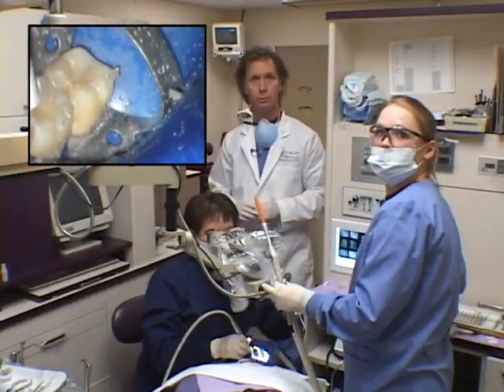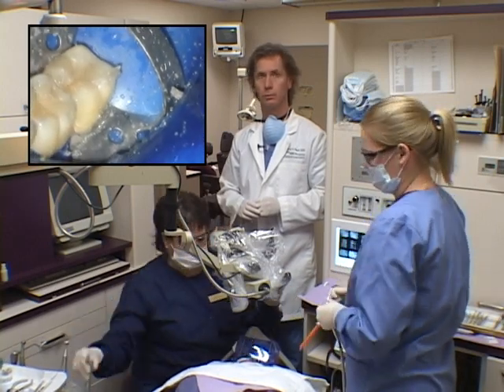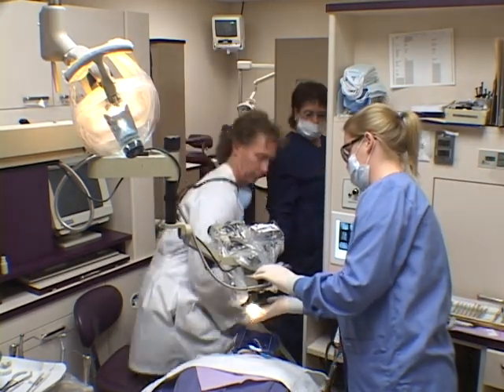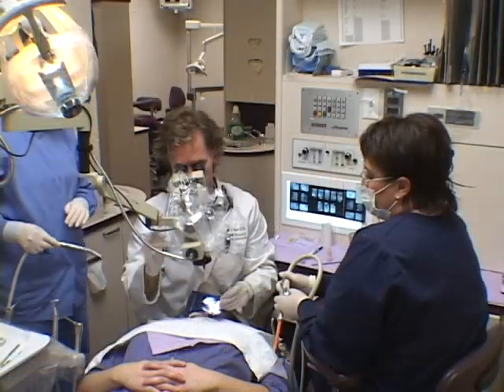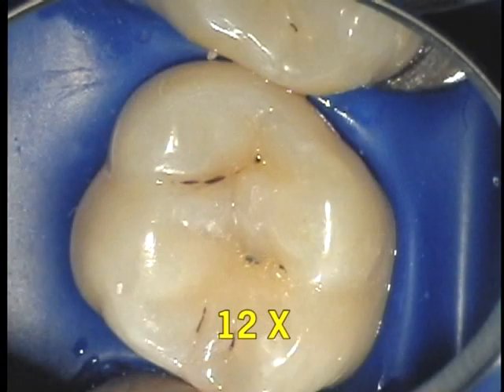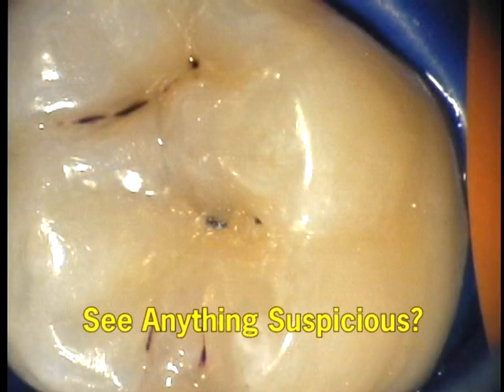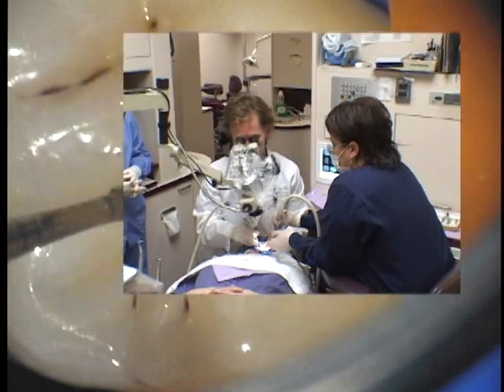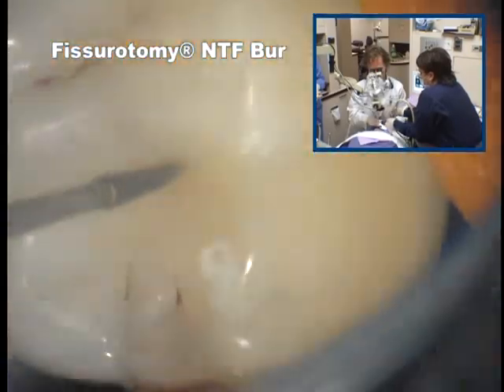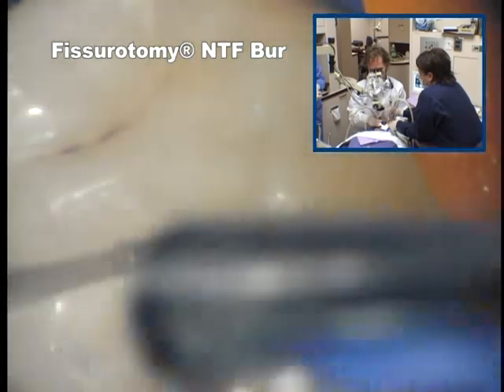The tooth must be cleaned with sodium bicarbonate, pumice, and finally with fissurotomy burrs. Here, I am removing decay and decontaminating the grooves. There is simply no other way to thoroughly clean and inspect these deep troublesome grooves.